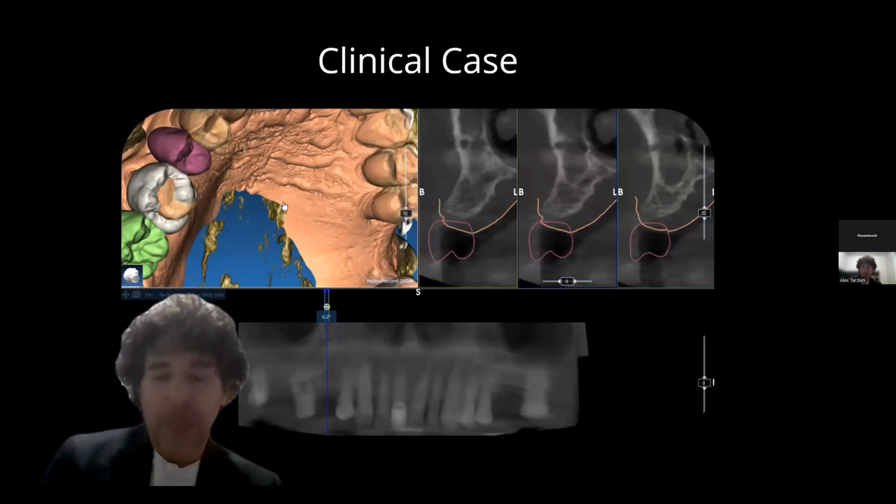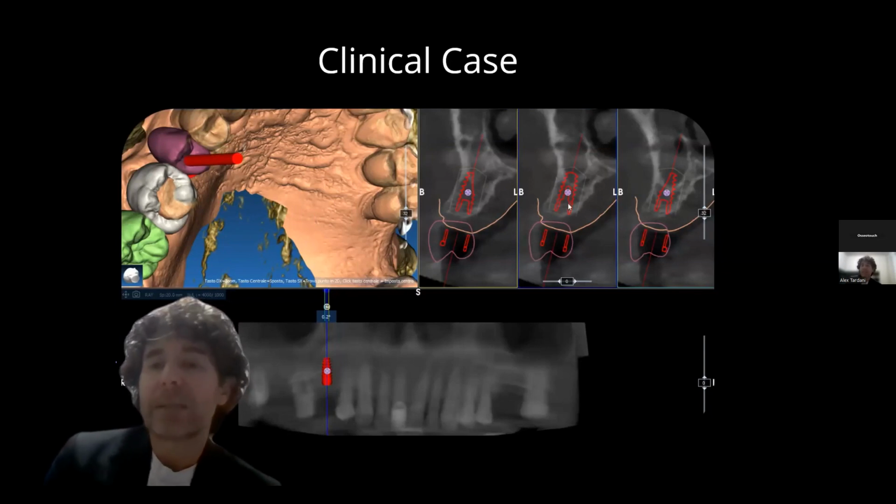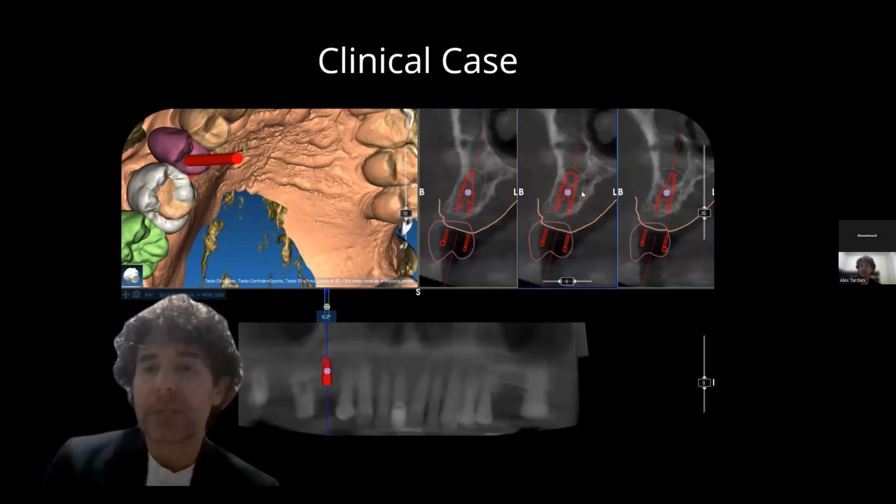At the same time, what did we do? We obviously performed an evaluation. So, what did we assess? As you saw from the arrow, we saw that in this case, the alveolar antral artery is present, clearly visible, and within the bone structure. We can see how the maxillary sinus in this anatomical area is very narrow, and so a sinus lift will surely be particularly simple in the transverse dimension.